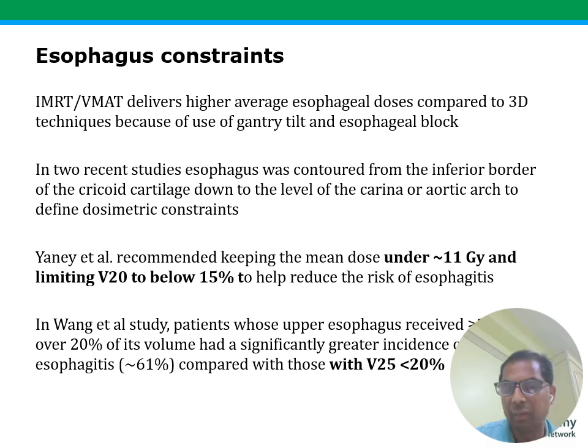So these are important numbers, both in terms of dose constraint and also in terms of defining the denominator, because these are the 2 common practice patterns I noticed, where people contour the entire esophagus and aim for a different mean esophageal dose. I'll show you some examples of that.